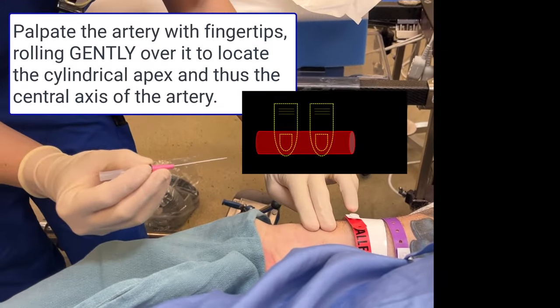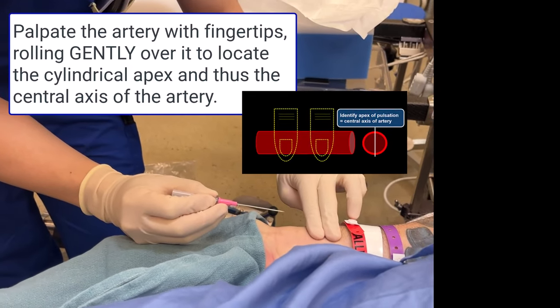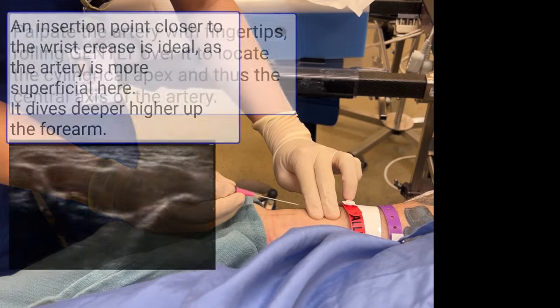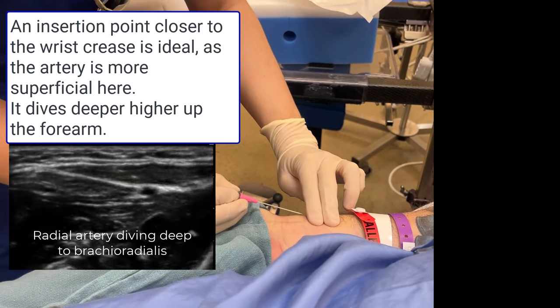Gently palpate for arterial pulsation with second and third fingertips, rolling over the vessel to determine its apex and thus central axis. An insertion point close to the wrist crease is generally preferred rather than more proximally, as the radial artery dives deeper further up the wrist.